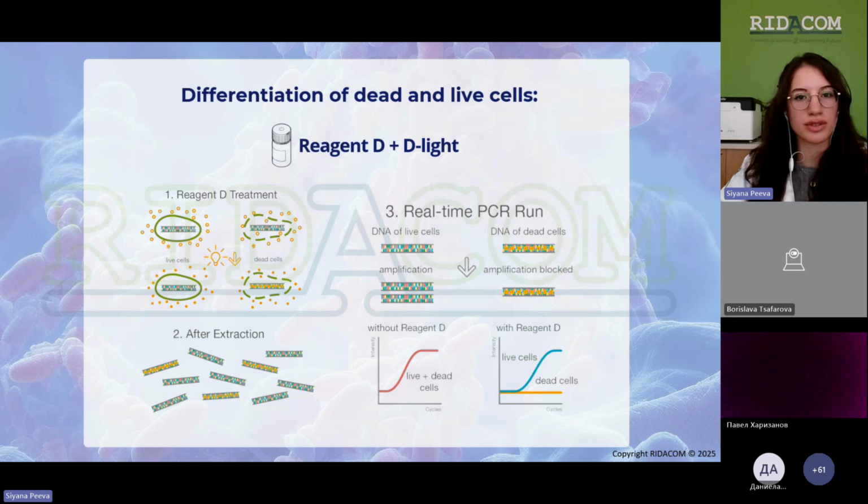So we cannot measure the risks here. But with the performed differentiation, we see the appropriate results of live cells, which are the dangerous Legionella cells.